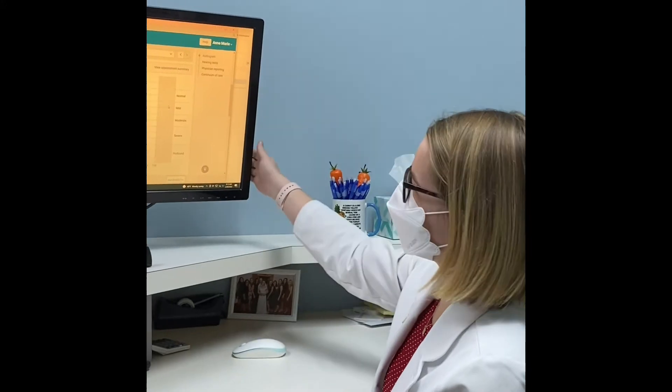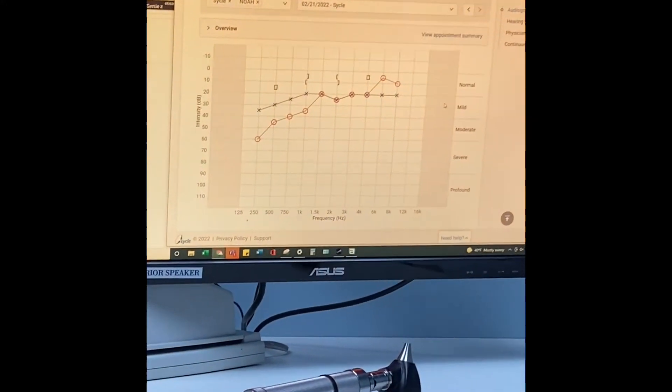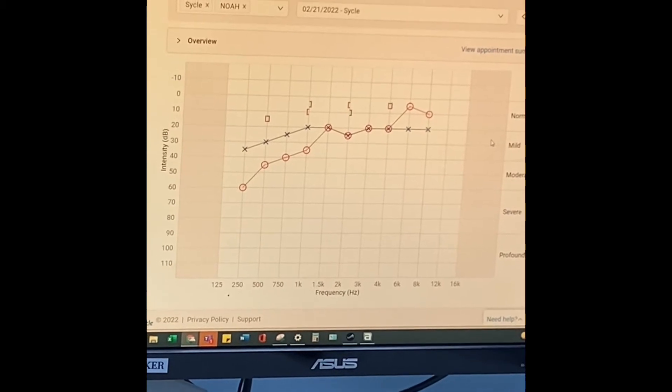Our patient care coordinator, Nathalie, has agreed to be part of the experiment. If you look at her recent hearing test, she has a mild-to-moderate low-frequency hearing loss in both of her ears, but more so in the right ear.